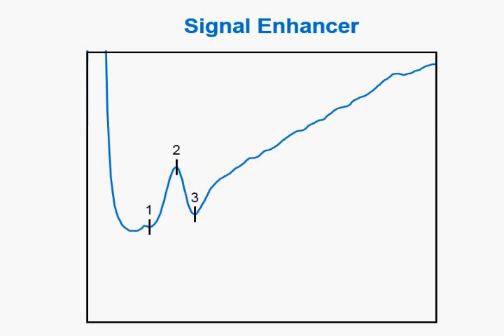Some systems offer digital signal processing algorithms to reduce the stimulus artifact. Here is a sensory nerve action potential recorded with the stimulation of medial antebrachial cutaneous nerve of the forearm. The distance between the stimulation and recording sites is only 10 centimeters, and hence we have a large stimulus artifact. Despite the artifact, we can easily recognize the sensory response.